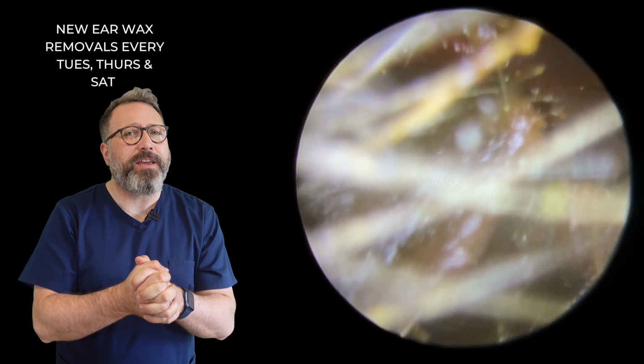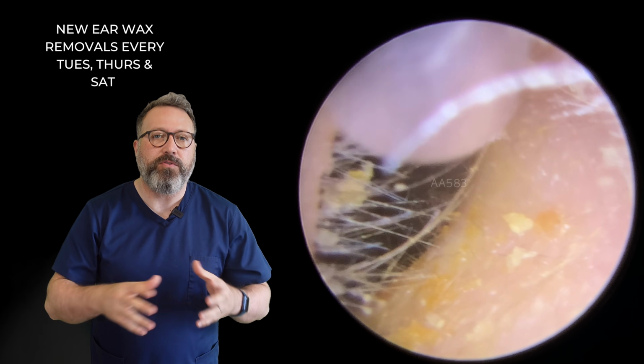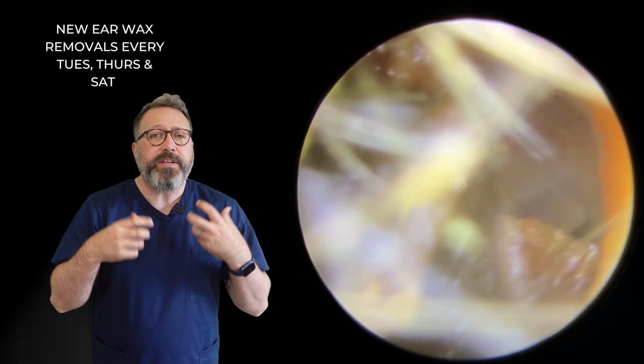Oh no, this lovely gent came through this morning. We actually squeezed him into one of our cancellation slots. So he came through, not prepared the ears at all, because he came through very last minute and got into one of our cancellations. And what we can see here is we've got very, very dry wax. Patient works in a really dusty environment.